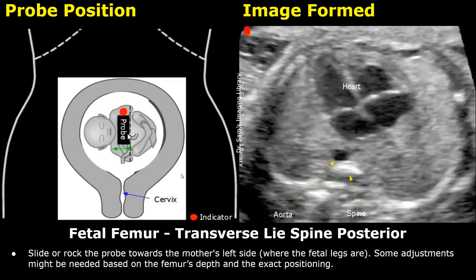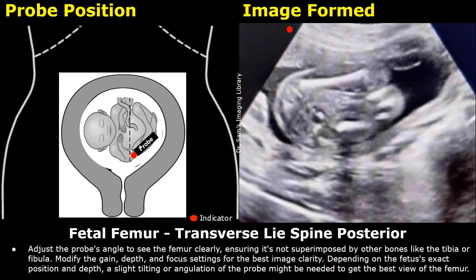This is a fetus in a transverse lie with a posterior spine. The head is towards the mother's right side and the legs are towards the mother's left side. This image is taken at the level of the heart, with the spine seen in the lower half of the image. To find the fetal legs, move the probe towards the mother's left side. Adjust the probe's angle to see the femur clearly, ensuring it is not superimposed by other bones like the tibia or fibula. Modify the gain, depth, and focus settings for the best image clarity.